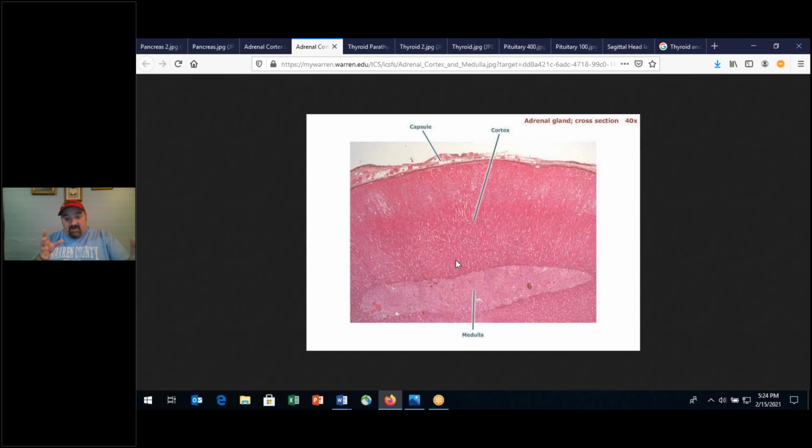There are a few in particular that I would like you to know, but as we look at this image, you go, okay, how am I going to differentiate between the glomerulosa, the fasciculata, the reticularis, the GFR? Well, here's the deal. If I point to the area that is not the capsule, so this outer layer, that's the capsule.